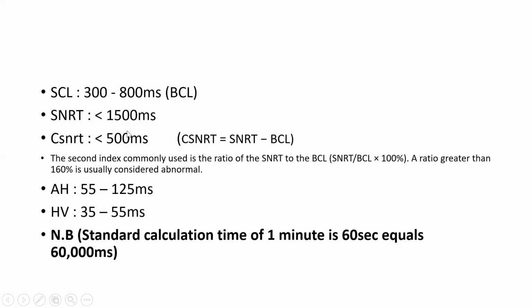Remember, we said one function of the EP study is to define the abnormality of the bradyarrhythmia mechanism, and one of the bradyarrhythmias is SA node dysfunction. So these parameters are very important in determining SA node function. Okay?